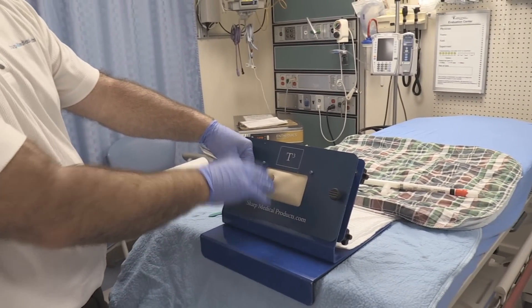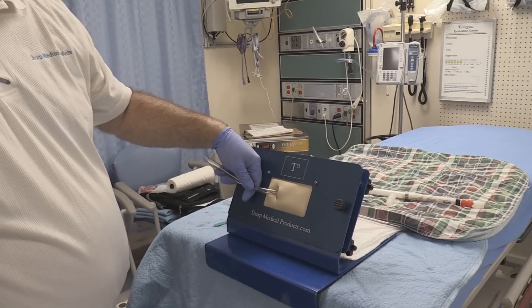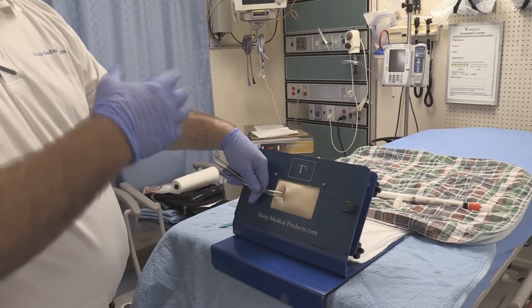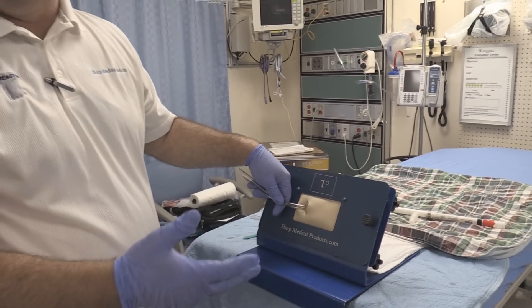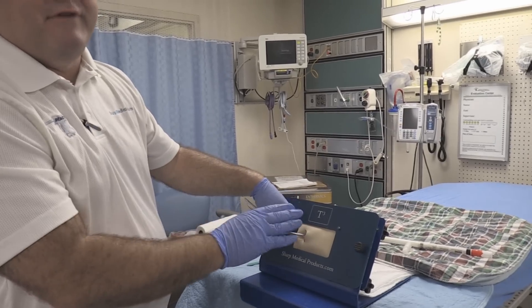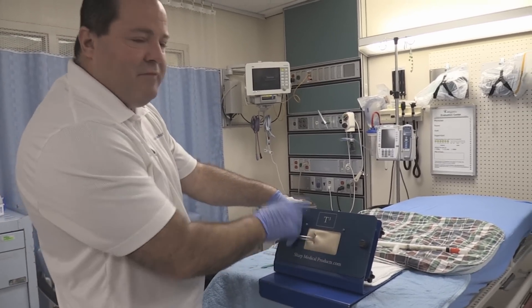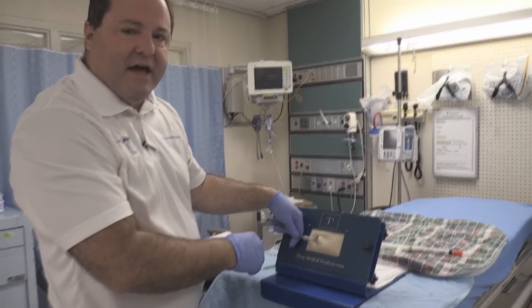We have a smaller incision — a smaller hole — and we did it a lot faster. I did about six clicks on that one, but sometimes it can be three for a smaller patient or ten for a larger patient. You just feel yourself going through the tissue, and as soon as you feel any give at all, stop firing and you should be able to slide it forward. If it catches at all, sometimes the sleeve might catch on a rib and you may have to twist it a little, but normally that's not the case.